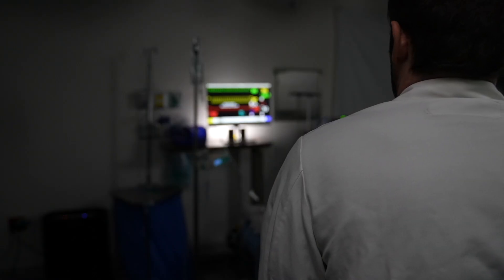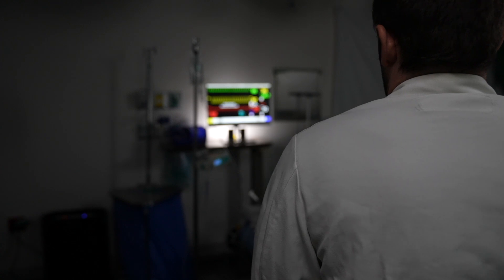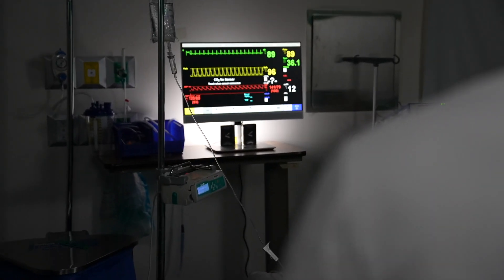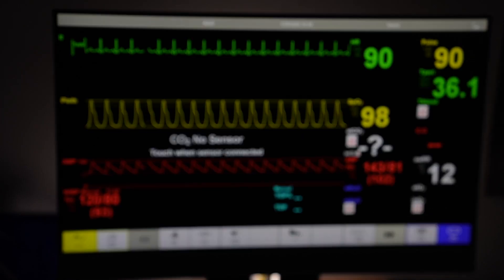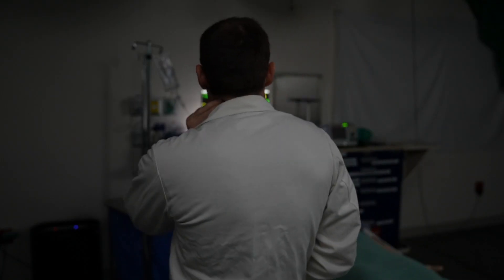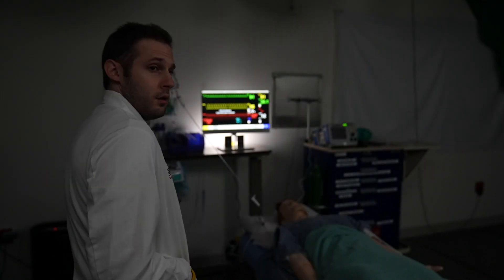I have 15 minutes to get this pre-round right, so I can present this patient and impress my team. Let's start with the heart rate — that's easy. Is that the blood pressure? Is that normal? Maybe I can get a nurse to help me or something?